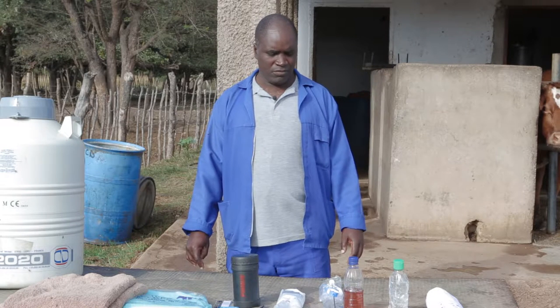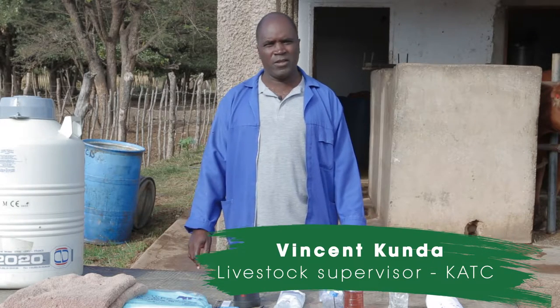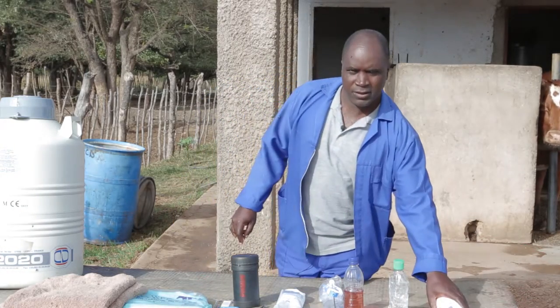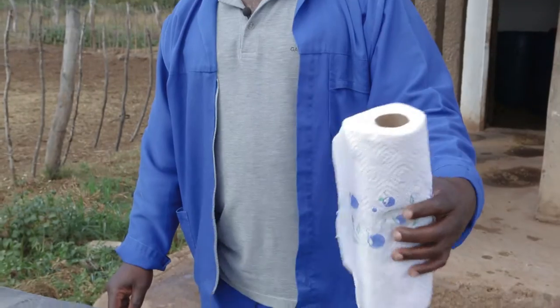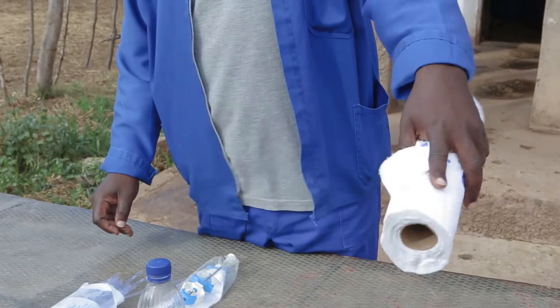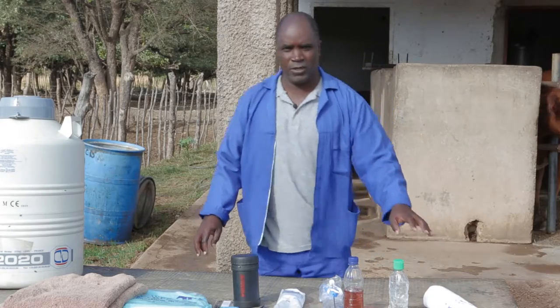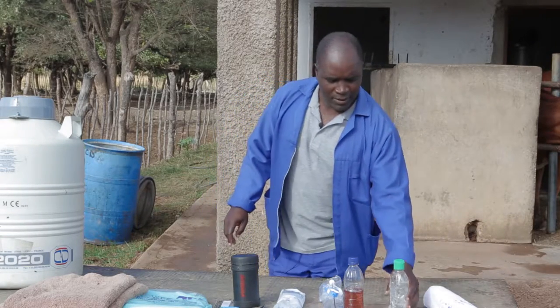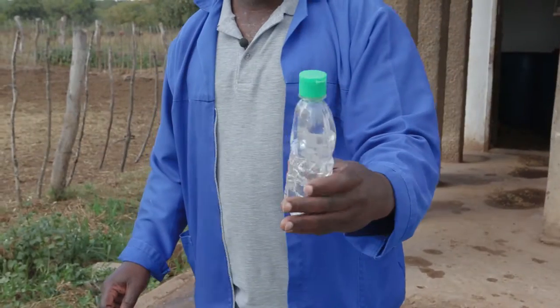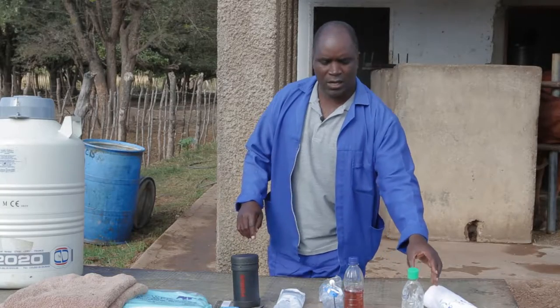I'm going to talk about the preparation and the equipment that we use for artificial insemination. This is a paper towel. We use this to clean the vulva so that all the dirt is removed before we insert the gun through it. And this is the lubricant. We use this on the hand before we go through the rectum.